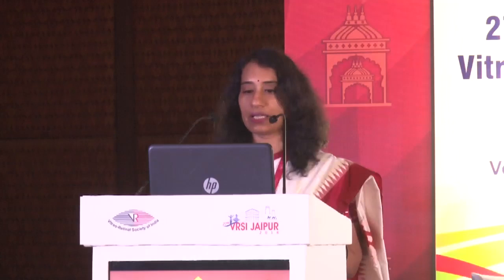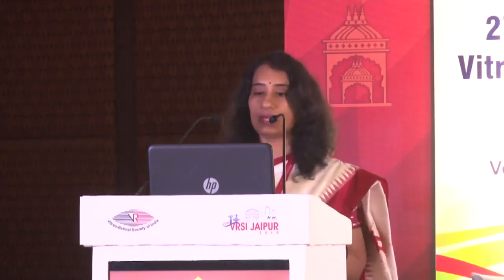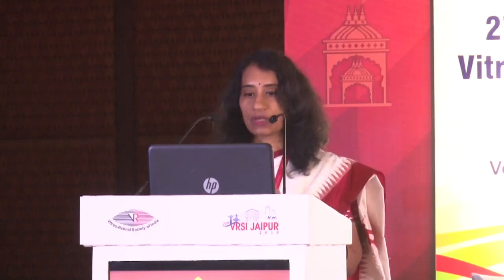And actually, depending on the ERG also, you can get an idea about the inheritance pattern in retinitis pigmentosa, because if it's X-linked at a very early age, the ERG may be severely reduced. Whereas if it is autosomal dominant retinitis pigmentosa, it's a later onset and a slower progression. And you have amplitude reduction alone without implicit time change in restricted disease. And this is again rod cone dystrophy.